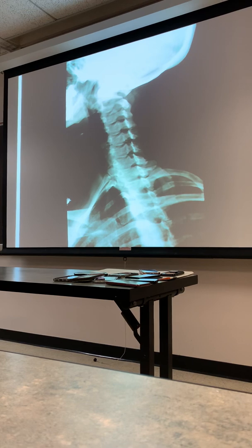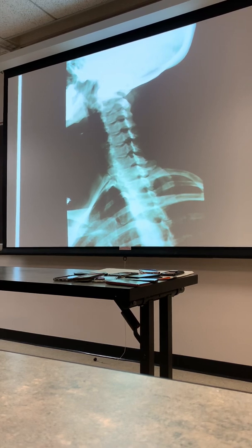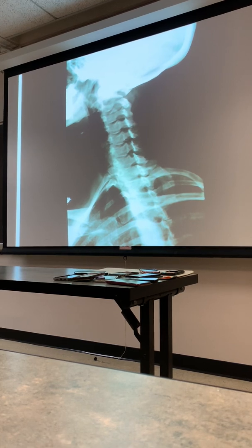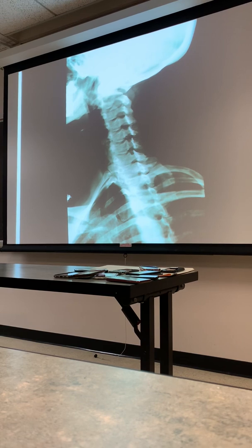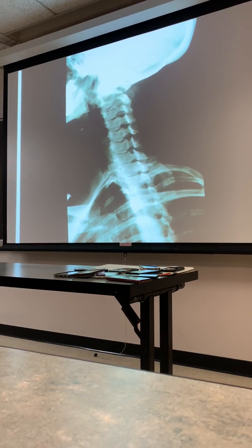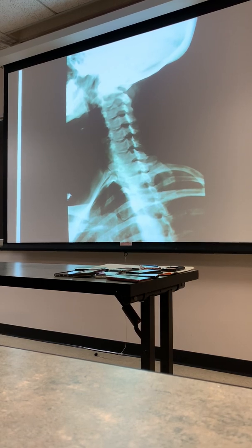Okay, the rule of thumb in all of these, don't worry about it, because nowadays we use one big size image receptor, but the rule of thumb is to put the top of the IR at the top of the ear and then just center to the center. You'll get it every time. You get the entire C-spine if you do it that way. 72 inches is recommended. Why? Decreased magnification. You decrease the magnification from what? OID. Because there's so much OID when we do these obliques that if we increase the SID, it decreases the OID. Remember that?